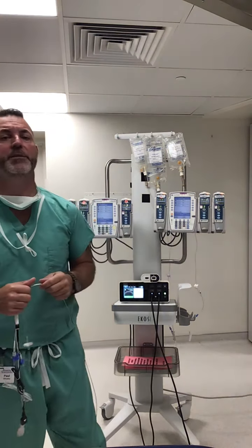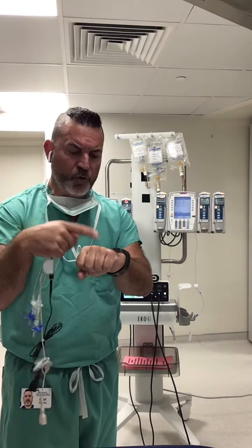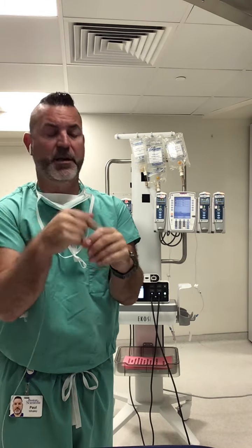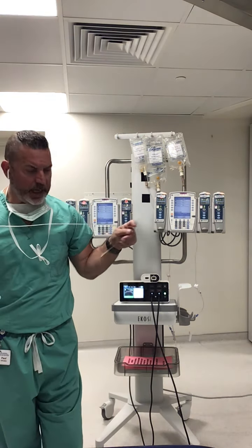However, when patients become symptomatic, here's what happens at the cellular level. The clot receives something else called fibrin strands, and the fibrin strands are literally covering the clot, making the clot larger and larger and a lot more tightly bound. So the TPA that we release in our bodies cannot penetrate that clot and dissolve it. So we use our EKOS catheter to dissolve that.